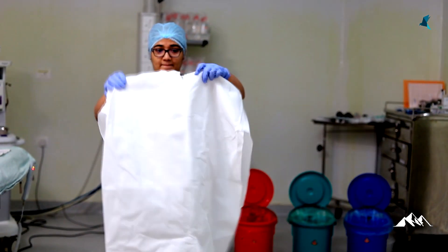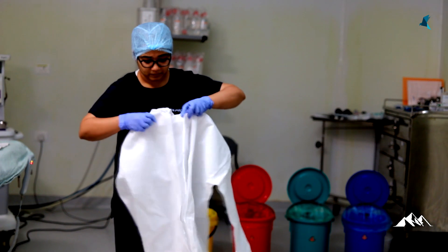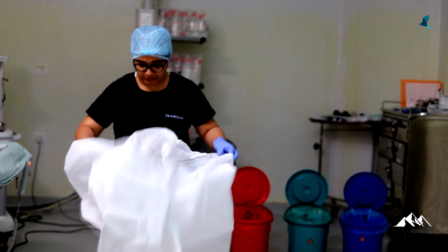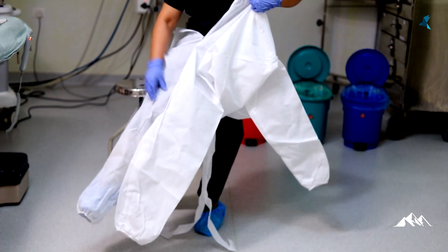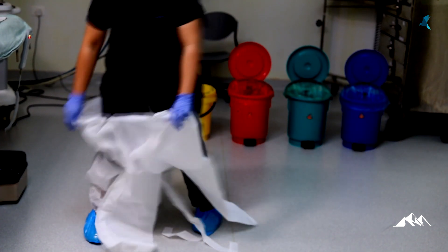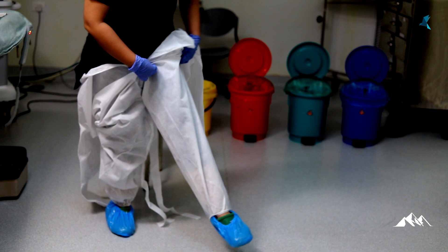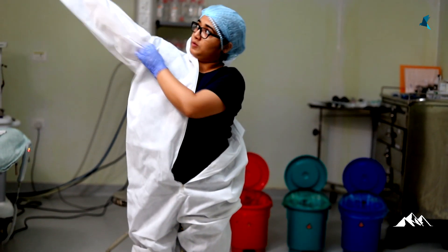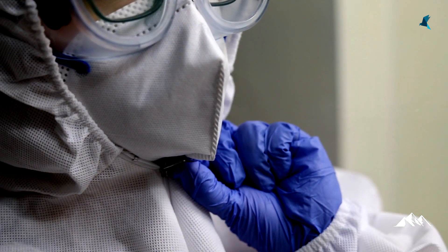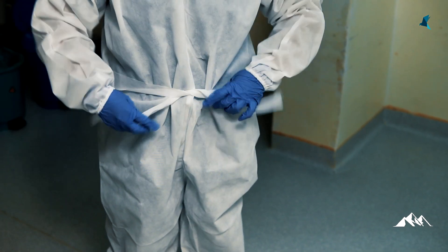Step 6: don the gown, also called a coverall. It is advisable to use a non-reusable, water-resistant, long-sleeve gown. If an impermeable gown is not available, place a waterproof apron over the gown. It can be back closure or front closure type. A back closure gown needs assistance from another healthcare professional. In the front open gown, there is a zip in front and a tie in the back, both of which can be tied by the personnel themselves. First slide legs in and then the arms. It is preferable to stand on a green sheet to avoid damaging the gown. After this, close the zip — the position of the zip is very important to avoid accidental unzipping afterwards. After the zip, knot the back tie.